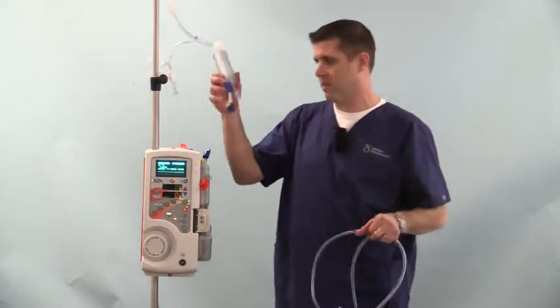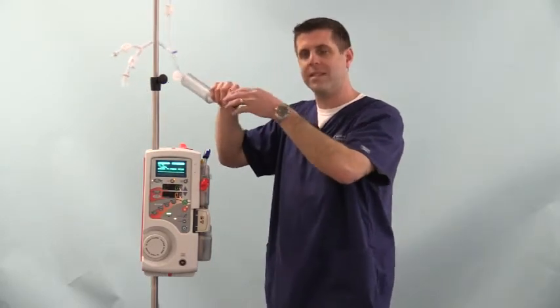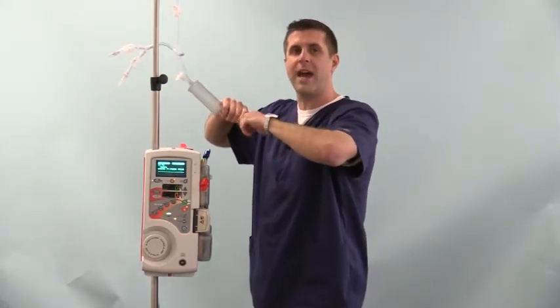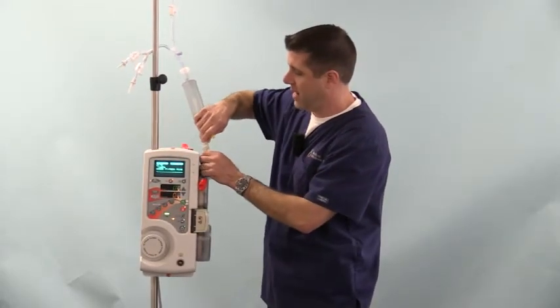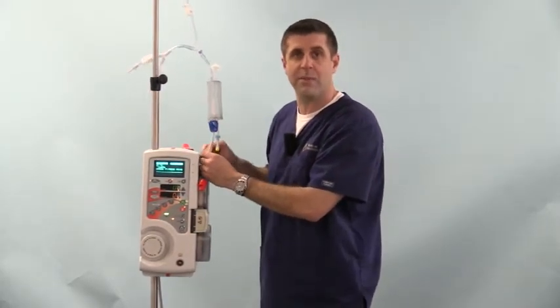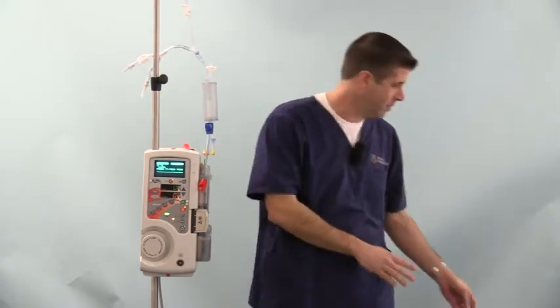First, I'm going to connect the triple spike, and all the caps are color coded. You can't set this up wrong. So I'm going to remove the blue cap from the triple spike and the blue cap from the cassette and make that connection. Underneath, those caps are also color coded. The connections are color coded clear.